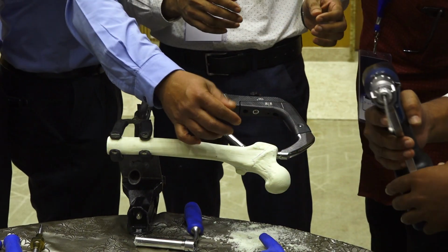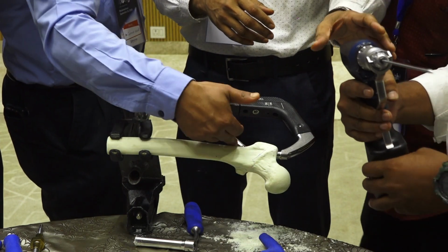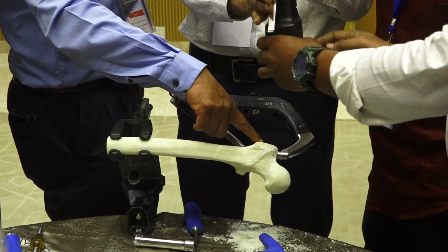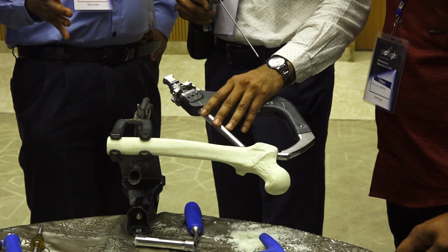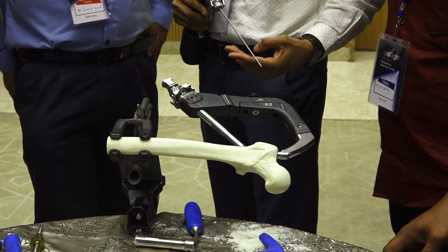Sometimes you get posteromedial comminution that extends into the lateral wall. So when you have a comminution in the lateral wall, how important is it to reduce it before you do it, or can you reduce it at the end?